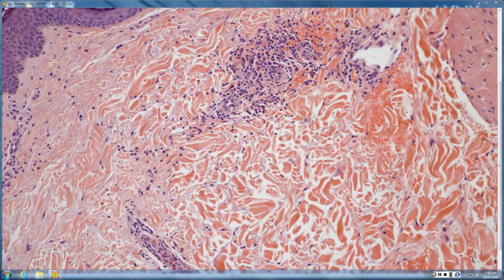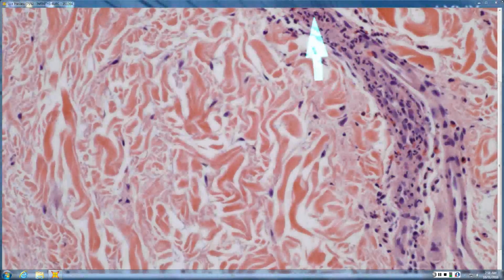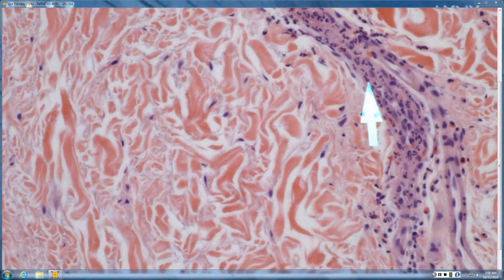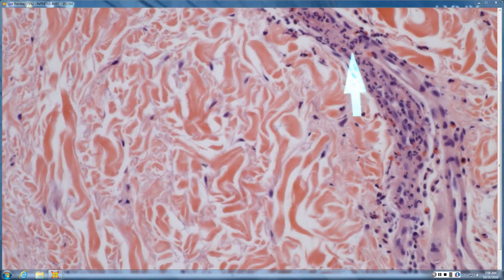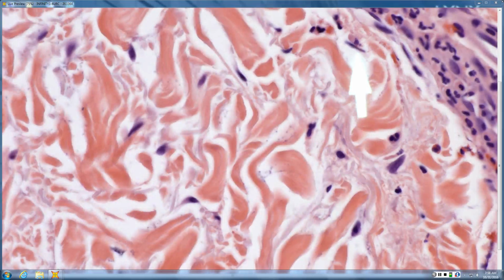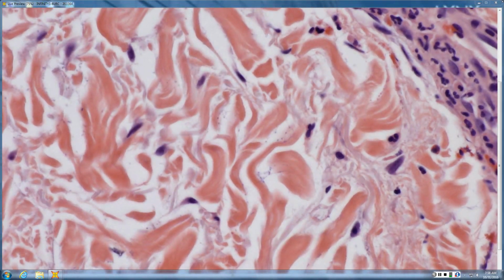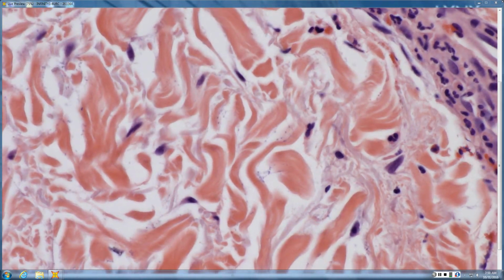This looks like a true vasculitis. You definitely have neutrophils around a vessel wall. Do you see any karyorrhexis, or are all the neutrophils intact? It looks like there's some karyorrhexis. If you can make out that the fragments are connected to one another or grouped, then it's an intact neutrophil.